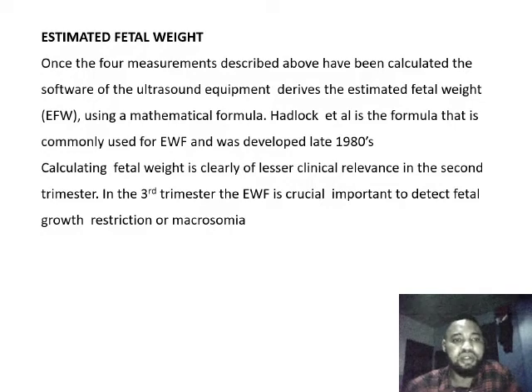Estimated fetal weight. Once the four measurements described above have been calculated, the software on the ultrasound equipment derives the estimated fetal weight, EFW, using a mathematical formula by Hadlock et al.